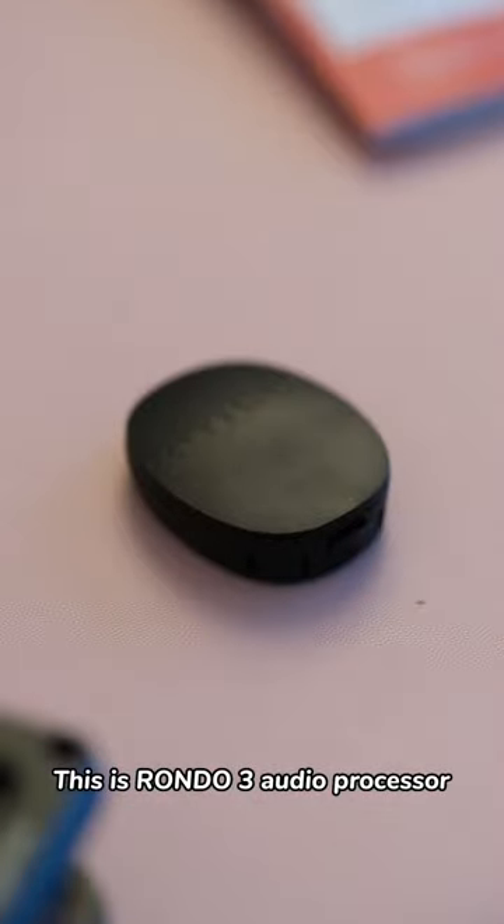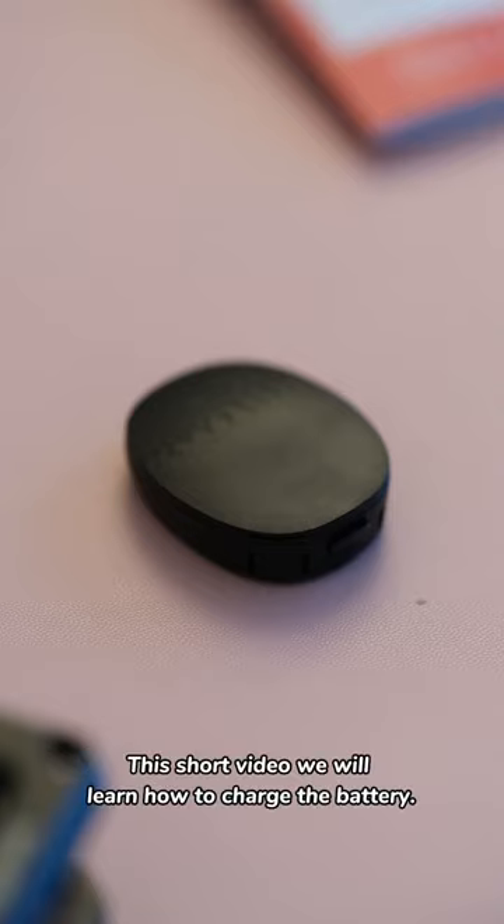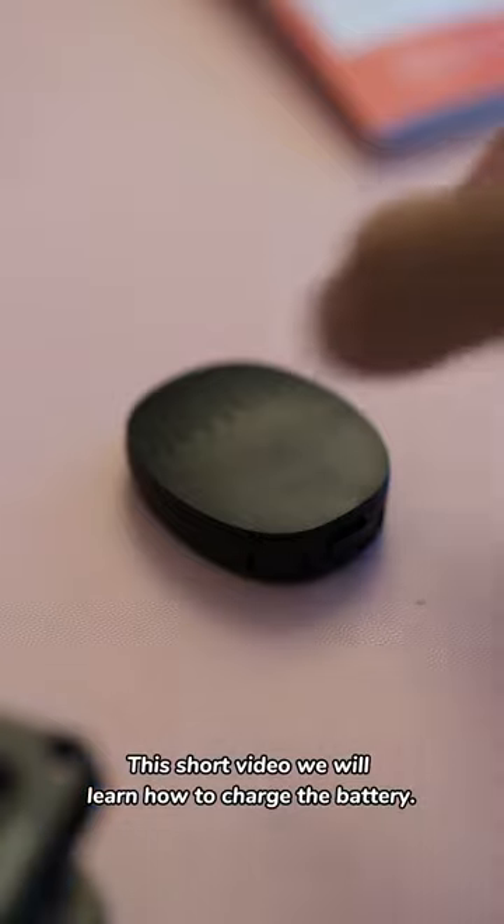This is RONDO 3 Audio Processor, the latest single unit audio processor for MED-EL. In this short video, we will learn how to charge the battery.